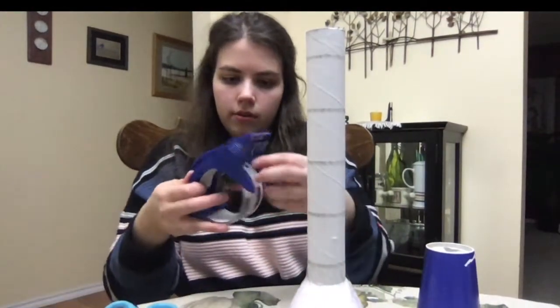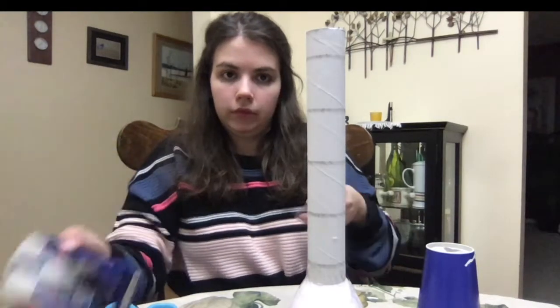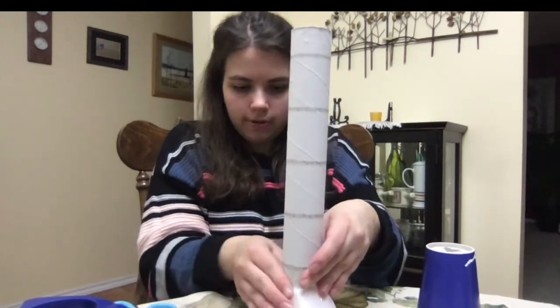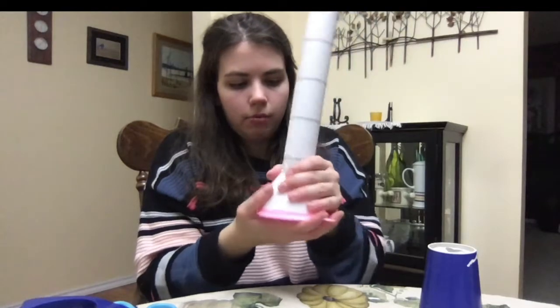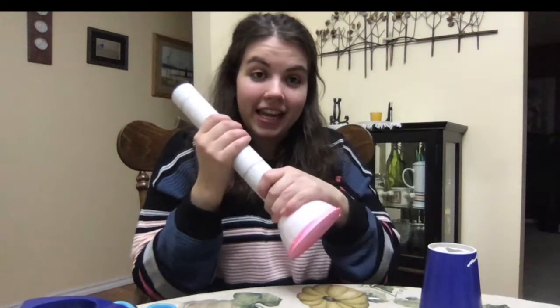Okay. Just a few more pieces, just to make sure it's nice and secure. Okay. There we go. So that's basically it. It's pretty easy, like I said.